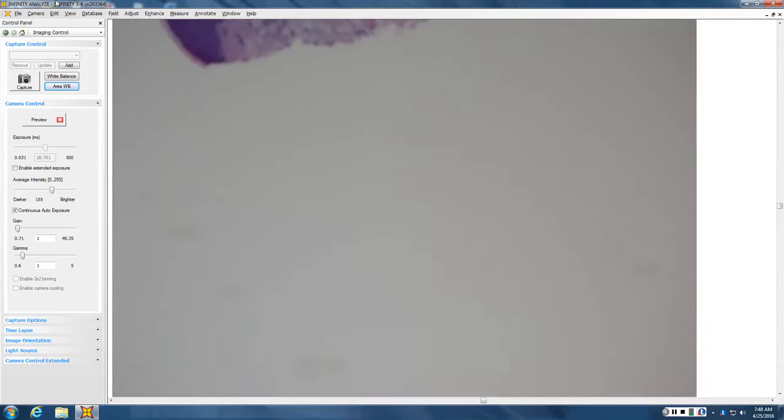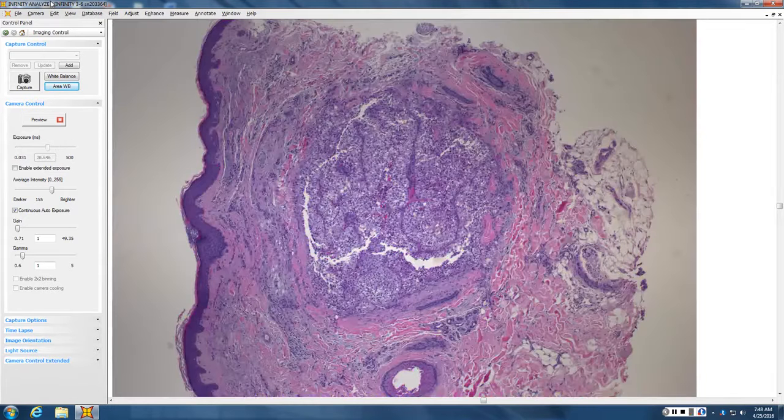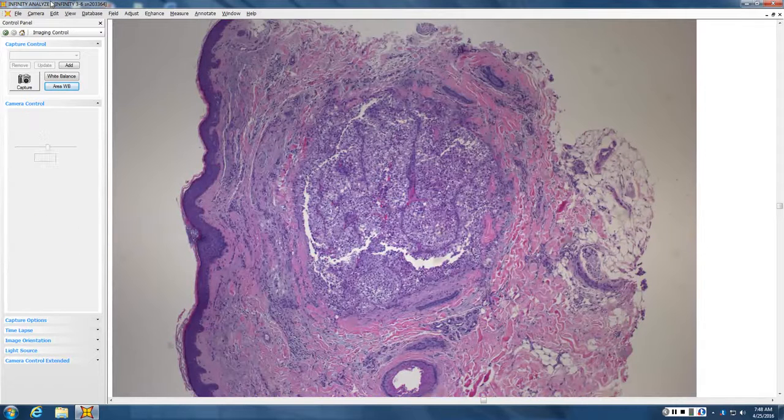Okay. Other ones that are more recognizable patterns, Christina? I don't think a lot of clearing out these cells. I know I don't seem to actually be clear enough for renal cell, but I know that's one where you think of cleared vacuolated cells. And actually, they are clear enough.